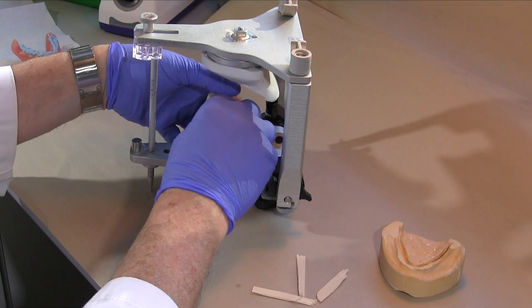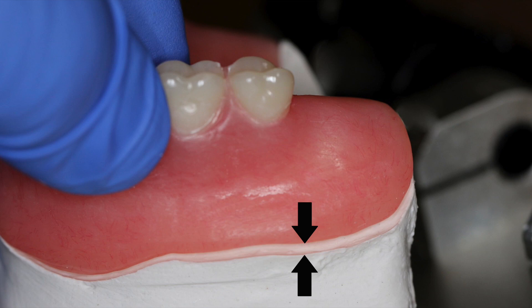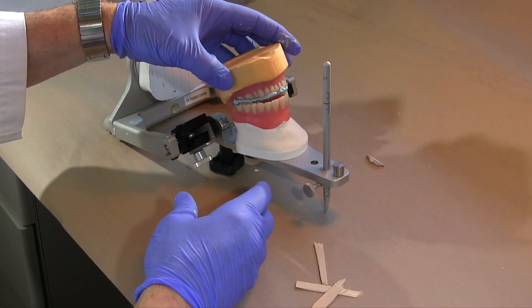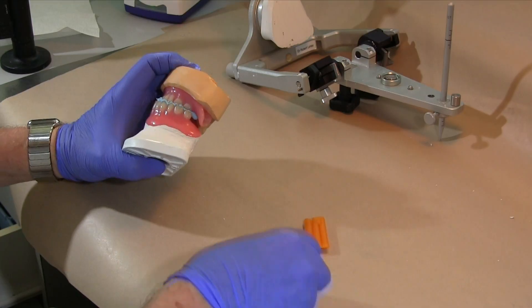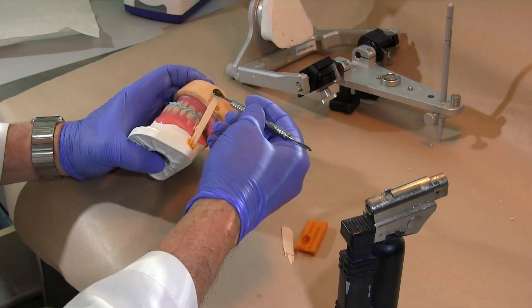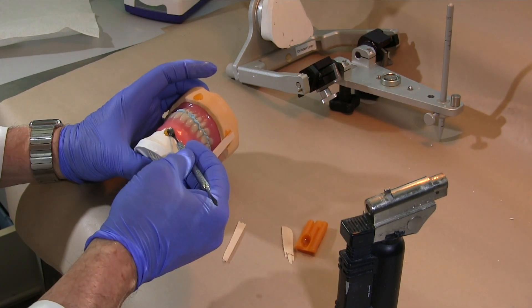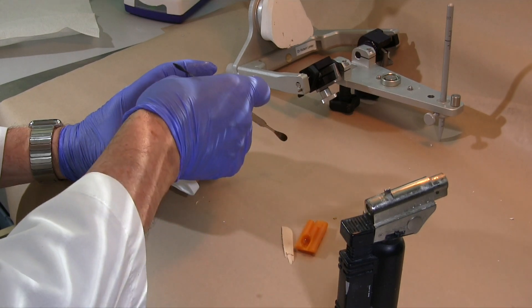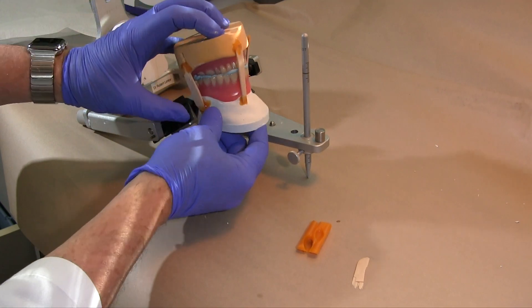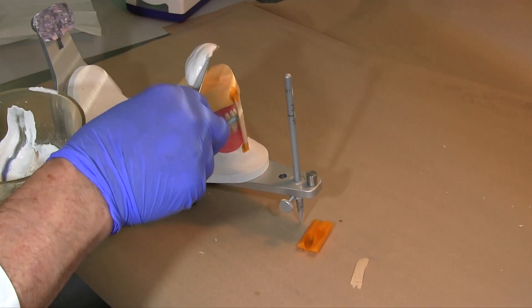Place the maxillary denture on the maxillary remount cast attached to the articulator, making sure no debris is trapped between the denture base and the cast. Mount the mandibular remount cast and denture using the record and immobilize the cast with sticky wax and wooden sticks. If the remount casts are damp, heat the area of the plaster to dry it where you plan to attach the sticks so that the sticky wax will adhere to the plaster. Ensure that the sticky wax is fully molded, not just softened. This will ensure that the sticks do not separate from the cast.